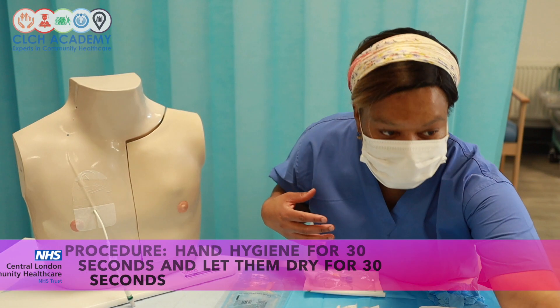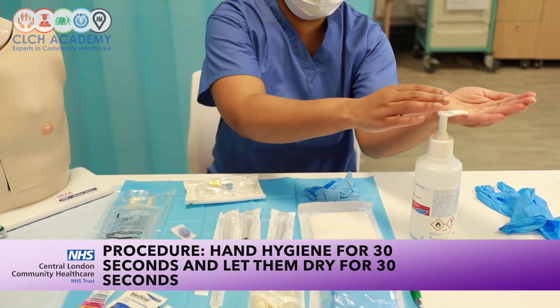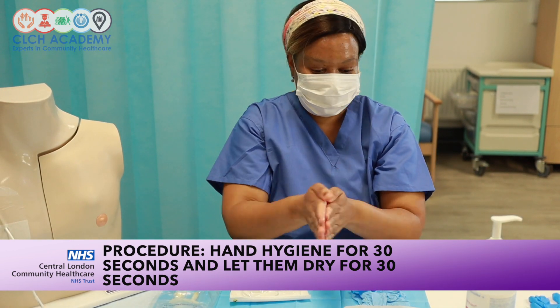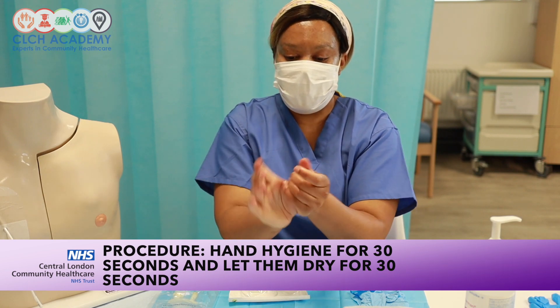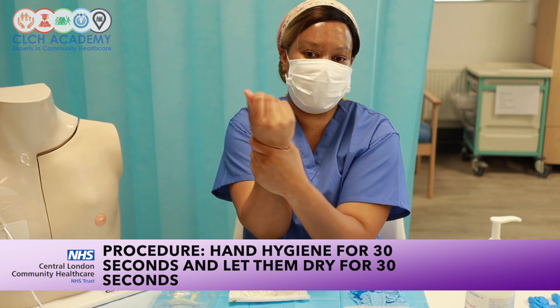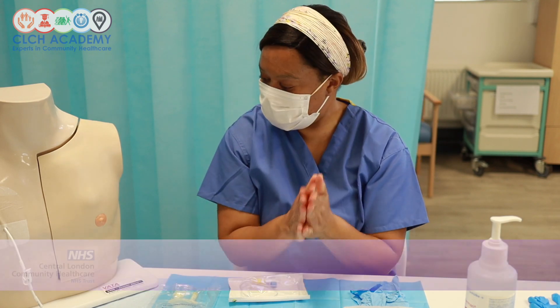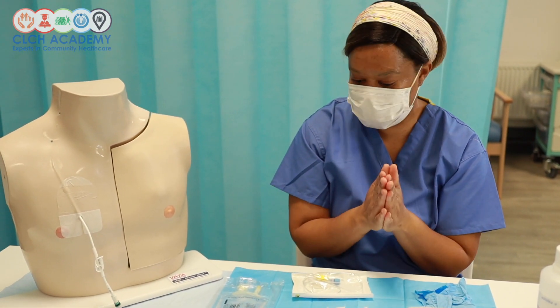As per usual, I'm going to decontaminate my hands. Good hand hygiene is key — fingers, fingers, fingers, wrists and wrists, bare below the elbows.